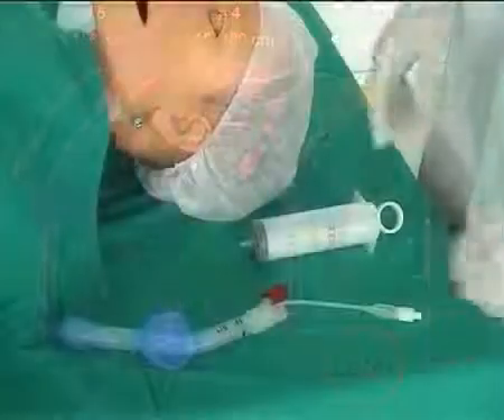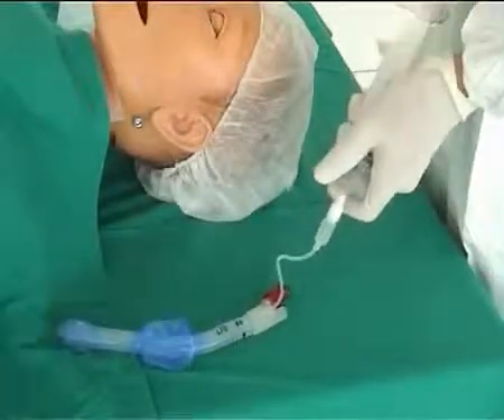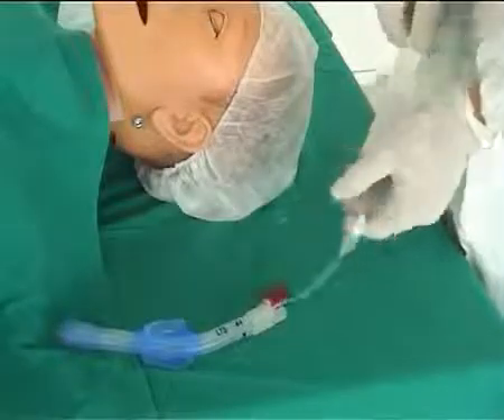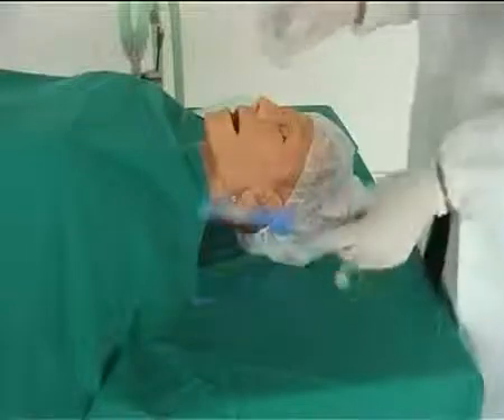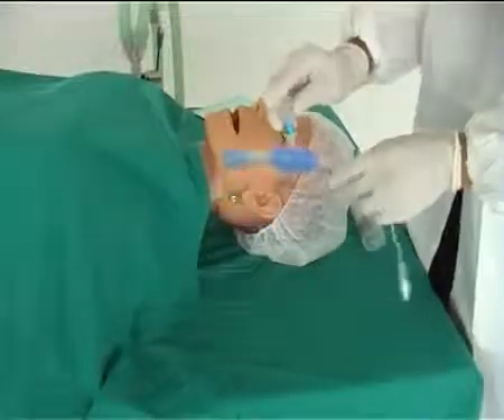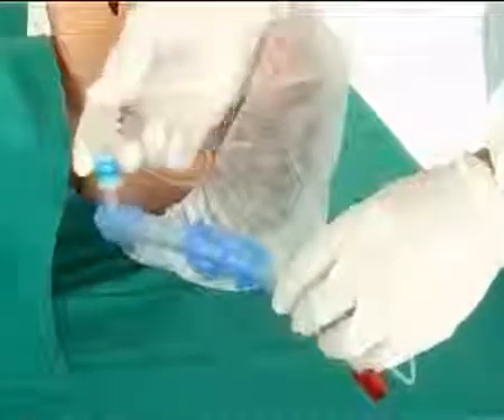Both cuffs are inflated with only one inflation line. Before insertion, they have to be evacuated completely with the syringe to avoid damage to the cuffs. To facilitate the insertion, the tube is either lubricated with sterile water or with water-soluble lubricant.